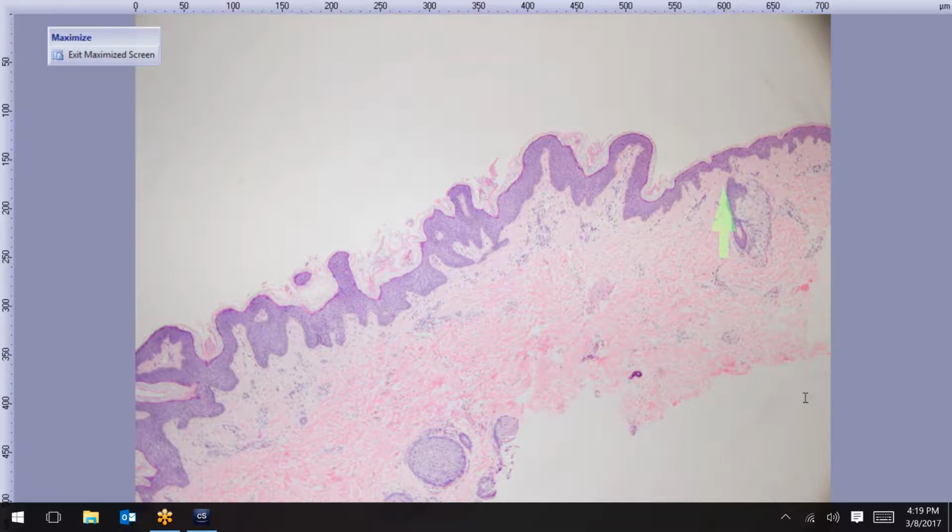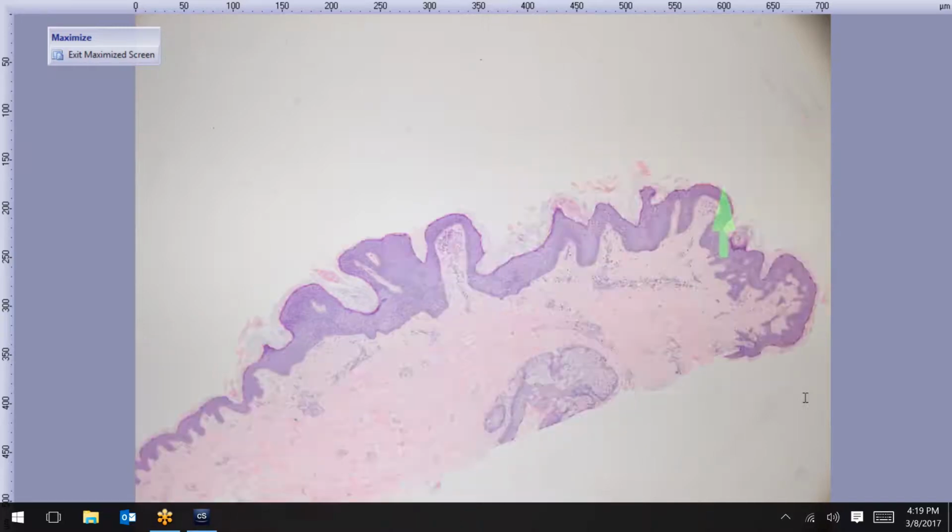Solitary lesions, say on a 12-year-old on the neck, then it's epidermal nevus, and that's what this context was. An elderly person with 50 of these on their back, then it's seborrheic keratosis. So this is epidermal nevus, and that's just a nice differential to remember.